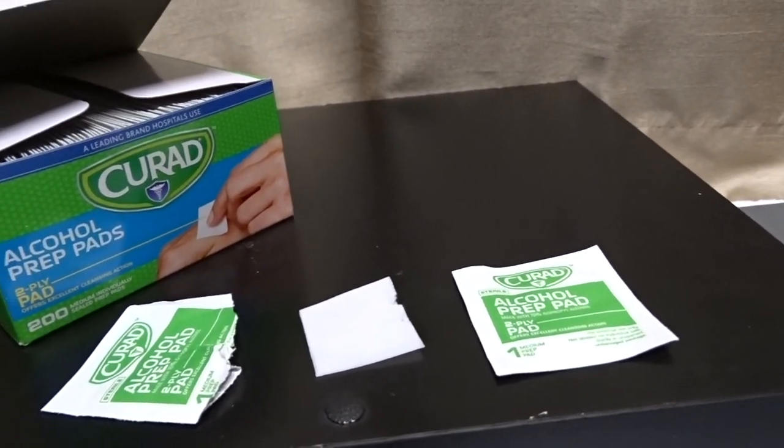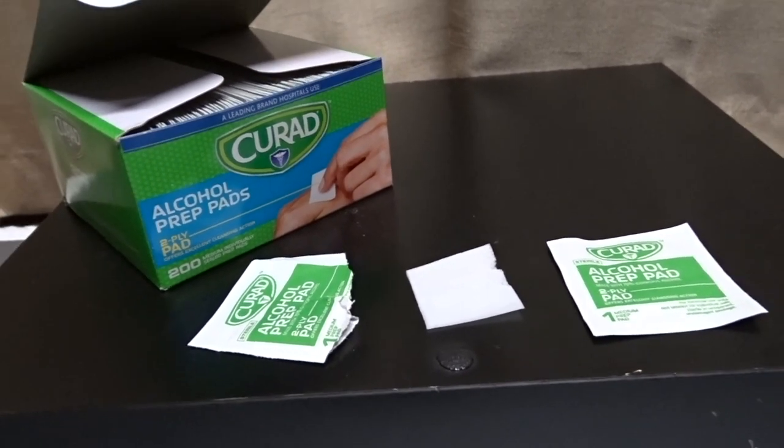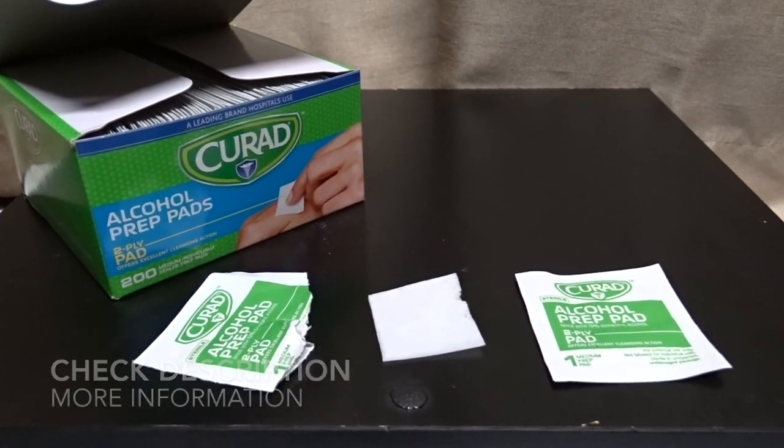We're talking about the Curad sterile two-ply alcohol swab prep pads. I hope you guys can use this information — I'll see you again next time. Bye!